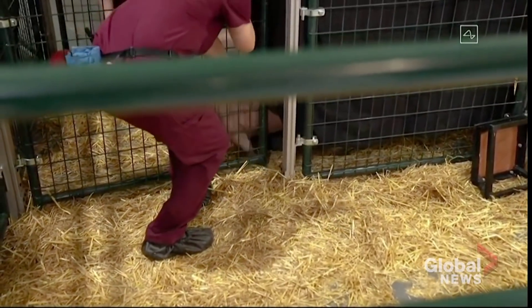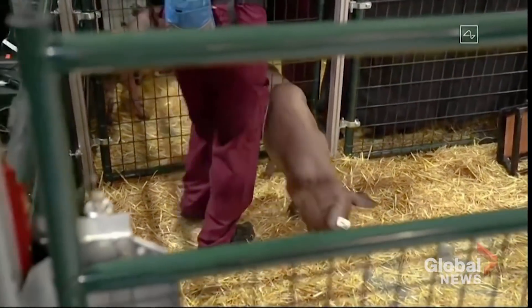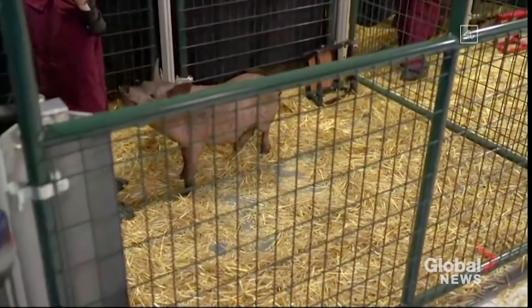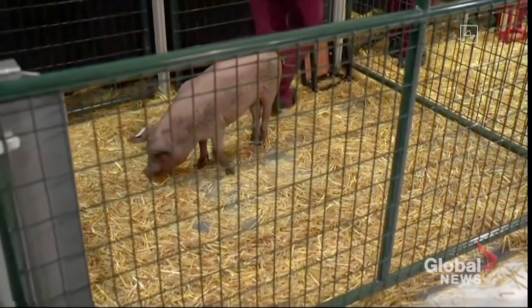We're able to show that you can actually have multiple neural links implanted, and again, healthy and happy and indistinguishable from a normal pig. It's possible to have multiple links in your head and have them all be sending out signals, and you're working well.